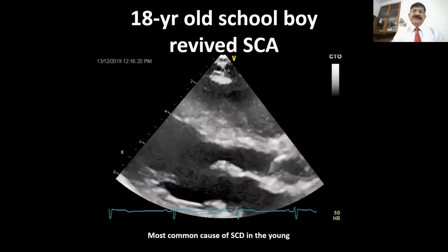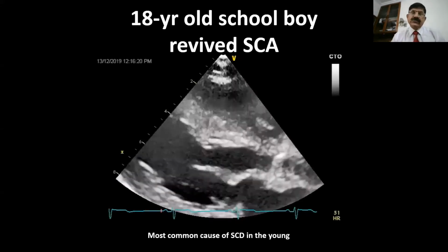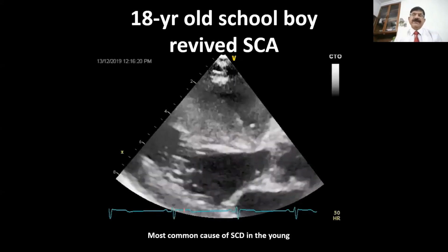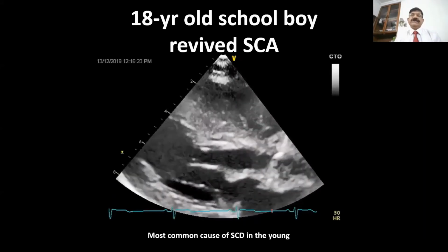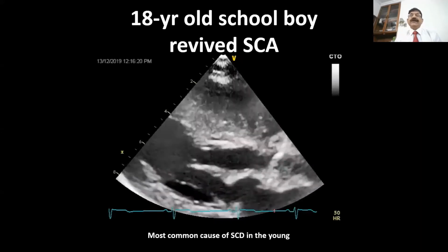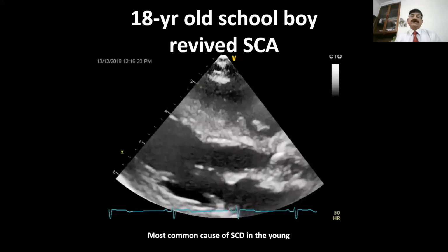Before I start the presentation, let me just show you a parasternal long axis view of a young boy whom I saw just a few months back. He's a 12th class student who actually had a sudden cardiac arrest in his school at 8 a.m. in the morning. He was revived and was sent to me.